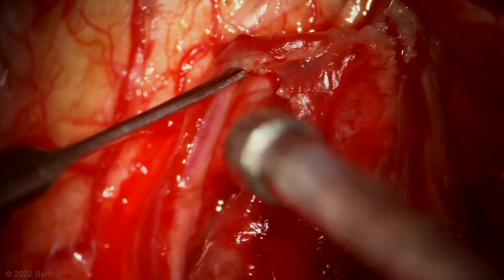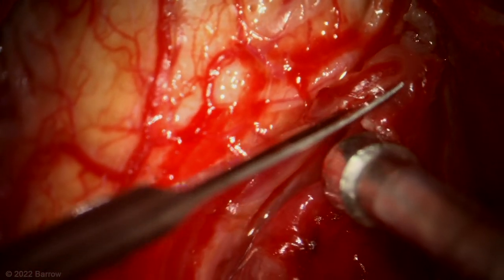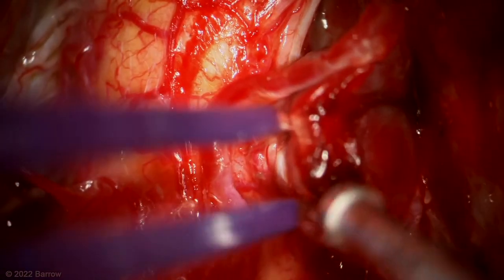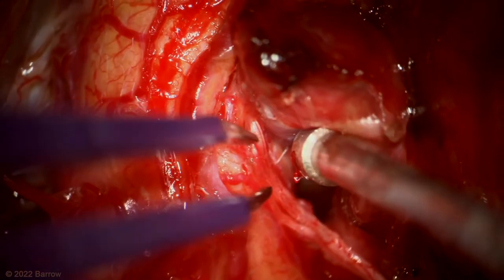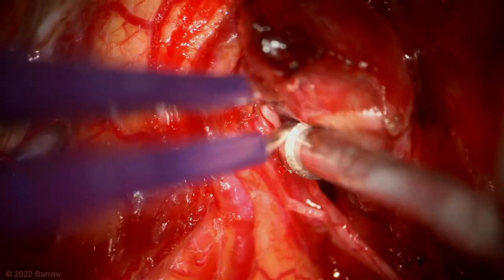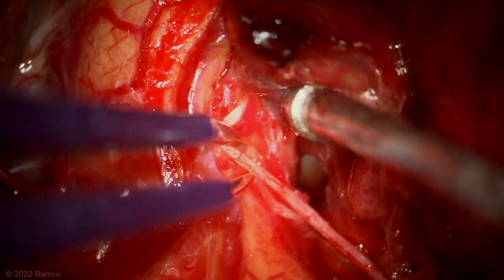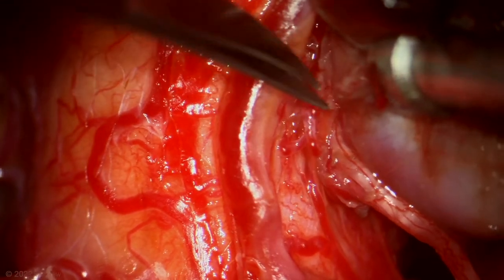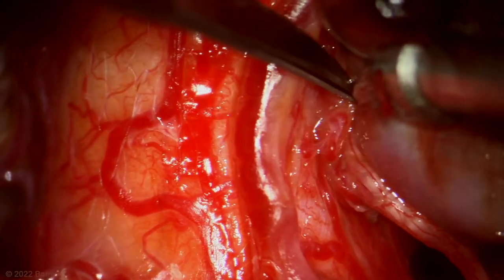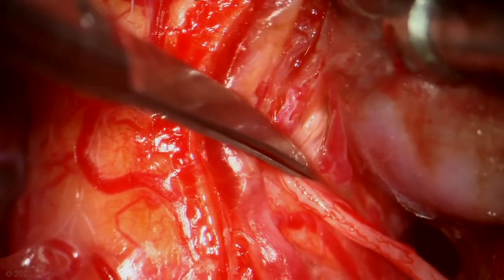Here, the distal PICA is being freed from the wall of the aneurysm. This thick scar tissue indicated prior, and probably multiple prior, hemorrhages. Notice the accessory nerve, which was adherent to the sidewall of the aneurysm. Care was taken to preserve the accessory nerve and to mobilize it away. In addition, all perforators were carefully preserved.